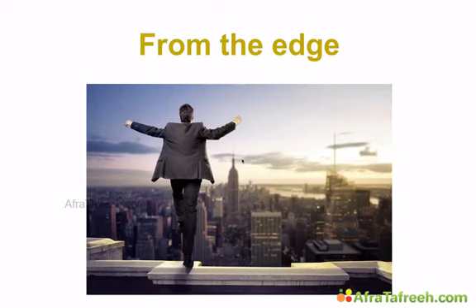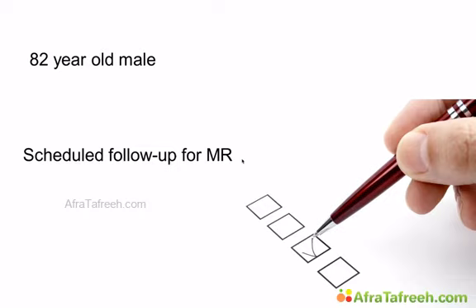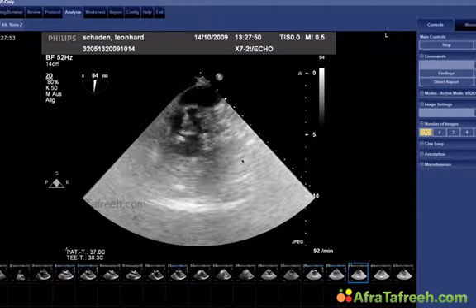Next case I would like to show you, I will call from the edge. This is a patient who came in with mitral regurgitation for just a routine checkup. We know that he has mitral regurgitation, so this was not a surprise to us, but I still want to show you something which is very interesting and which you should be aware of when you perform echocardiography.